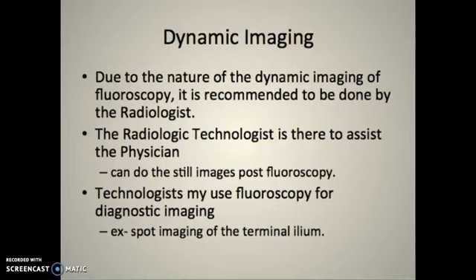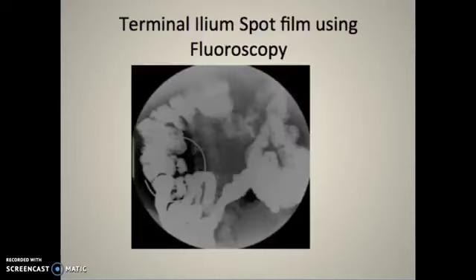Fluoroscopy is not to be used to position patients. That was going on for a while, where people would use fluoro to make sure that they're positioned, like for a swallow function video. That is actually illegal. You are not allowed to do that. So you're there to assist the doctor and help them position the patient, give the barium or the contrast as they request, and you're mainly there for the patient and to do follow-up images for the radiologist.